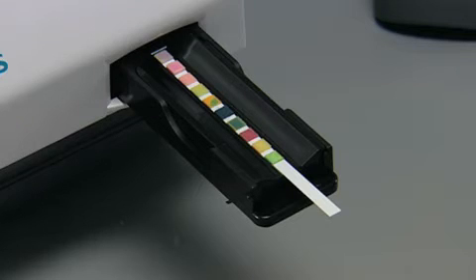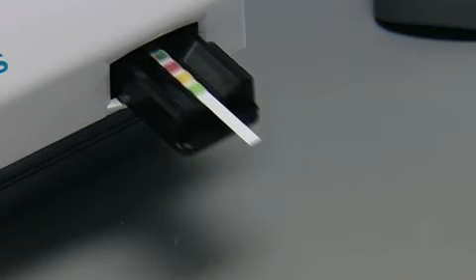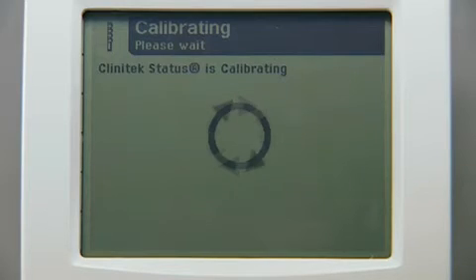At the end of the eight second countdown the analyzer automatically pulls in the test table. The analyzer performs an automatic calibration each time a test is run. Be careful not to move or bump the test table while the instrument is calibrating.